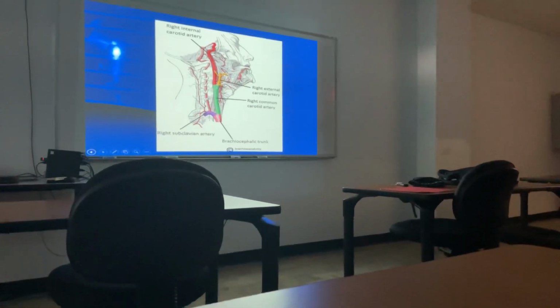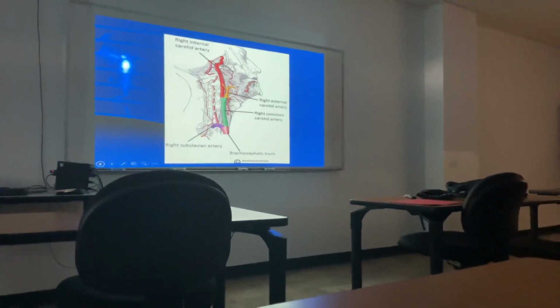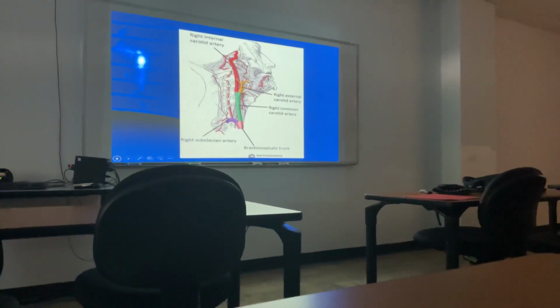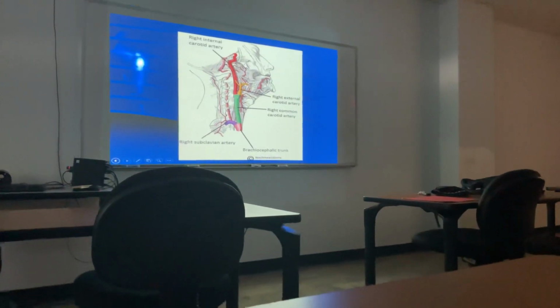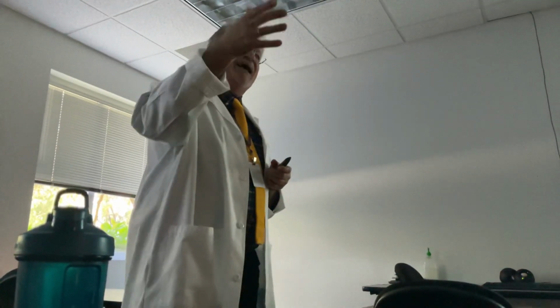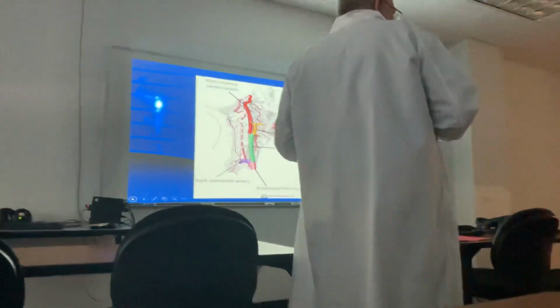Diagnostic ultrasound. And that same modality we're going to use for calcification in the carotids and the vertebral artery. So when you send your patient who has dizziness and you find this on your x-ray, especially if it's bilateral, they're going to do a diagnostic ultrasound of the carotids and the vertebral artery. That's the application to what we're talking about and learning about.